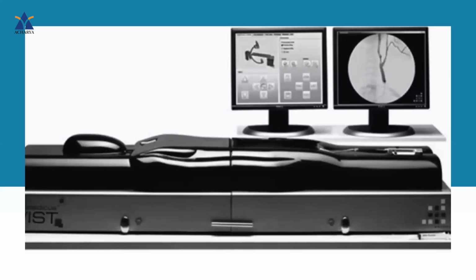So this is one example of how the simulation will look. This is a Procedicus VIST system from Mentis. It is a multimedia device designed to simulate endovascular procedures. It includes a wide variety of clinical scenarios like carotid, renal, and iliofemoral occlusive disease.